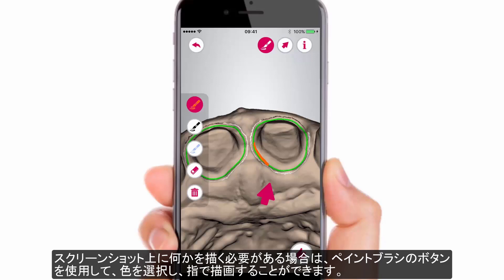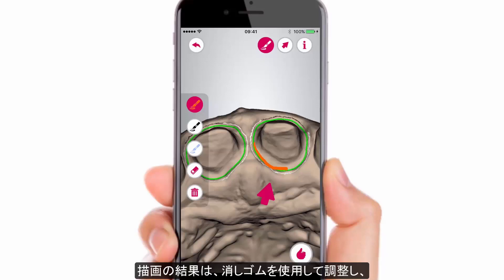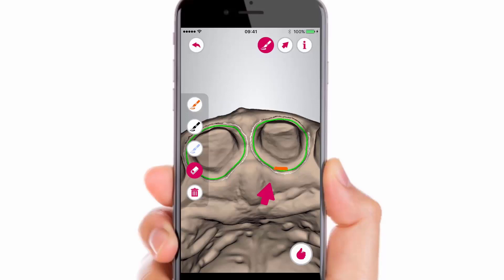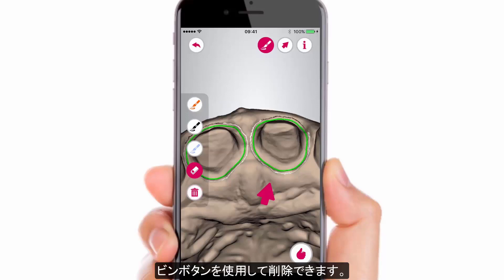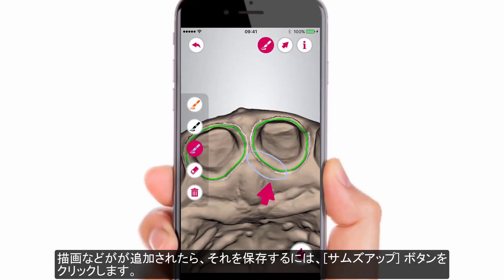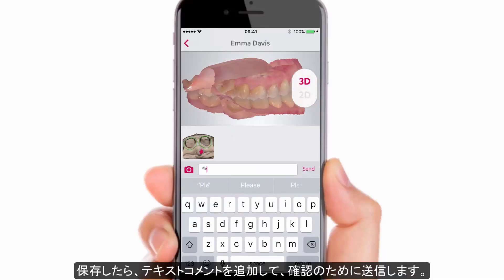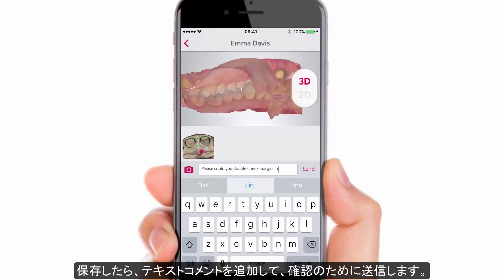Choose a colour and use your fingers to draw. It is also possible to use the Apple Pen on an iPad and other pen types on Android. Drawings can be adjusted using the eraser and removed using the bin button. When your drawings and callouts are added, click the thumbs up button to save and get the possibility to add a text comment and send it for consideration.